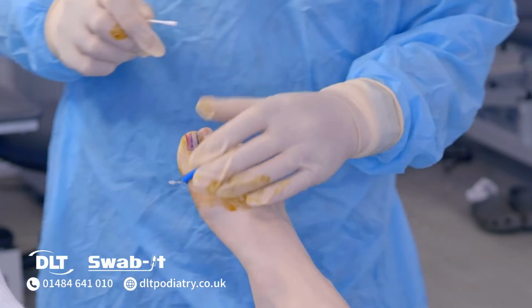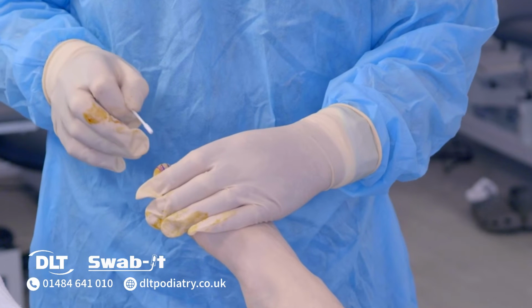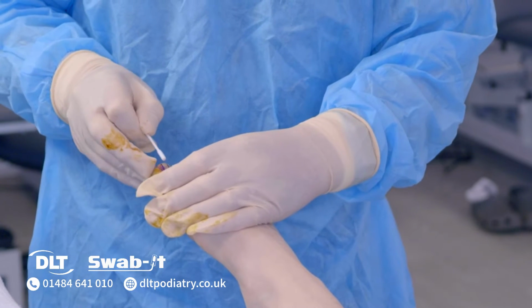Again, for the purpose of the video, we're not going to apply phenol to this area because the procedure is a total, and the patient's giving consent for us to demonstrate the wedge resection before we do the actual full procedure.